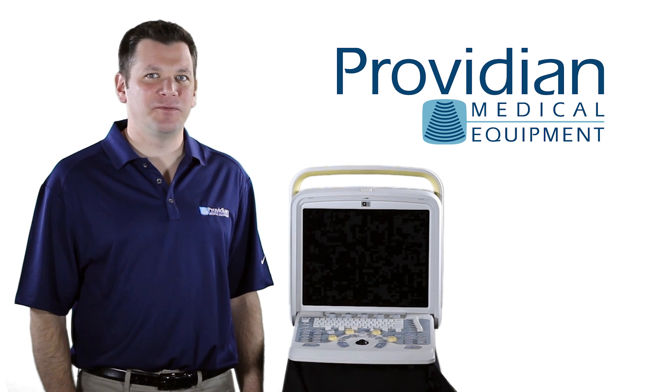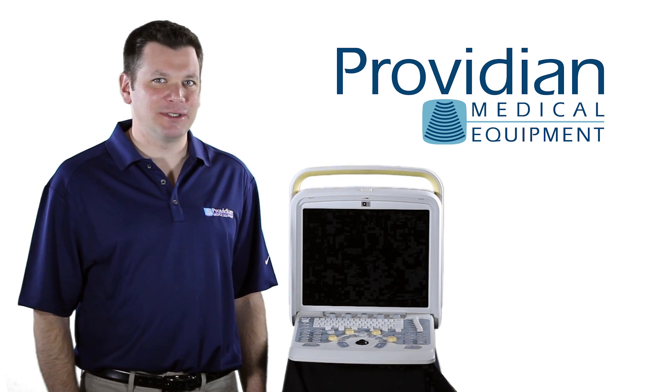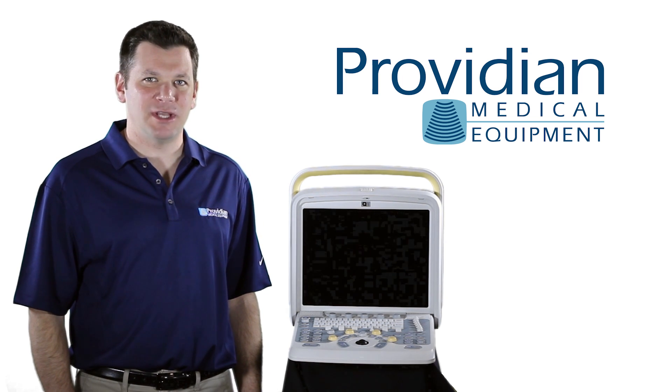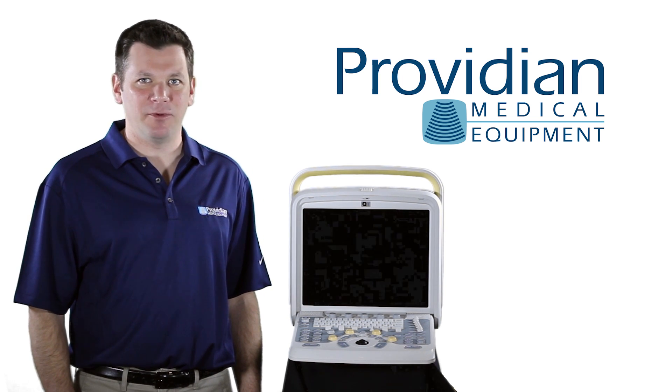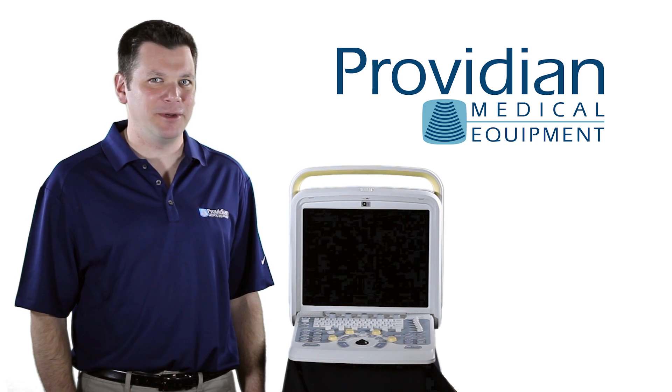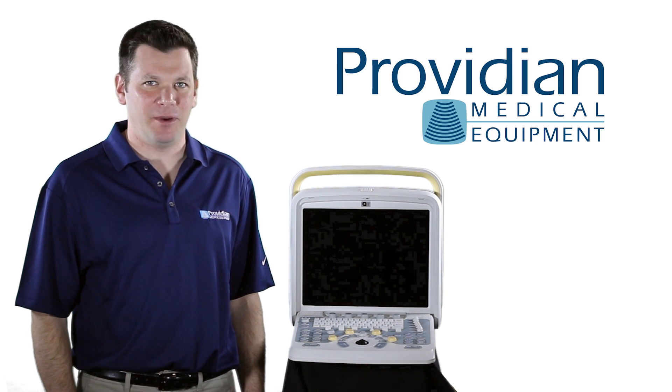The Q5 also features 4D obstetric imaging. I was unable to test it at the time of this review, but as most affordable portable ultrasound machines go, they're typically capable 4D machines and ultimately designed for OBs or other radiology departments who will be doing a limited number of 4D ultrasounds for their patients.